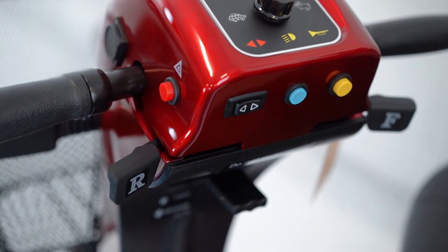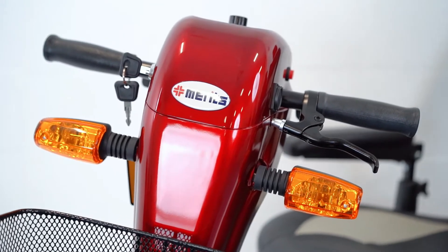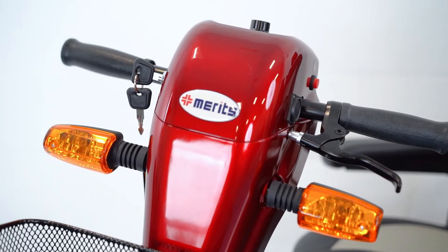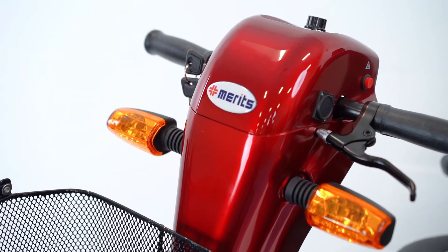This unit operates off electromagnetic brakes, which is common on most mobility scooters. Once you release the throttle, the brakes naturally engage. There's also an added handbrake for extra safety.